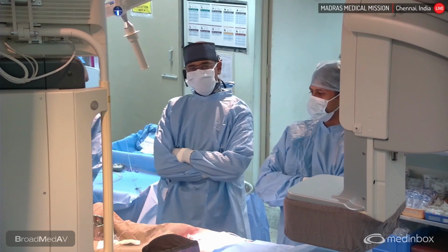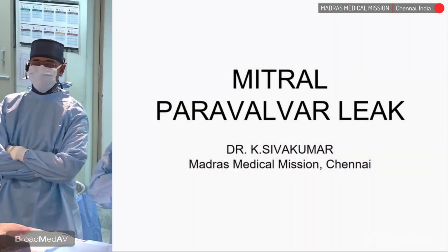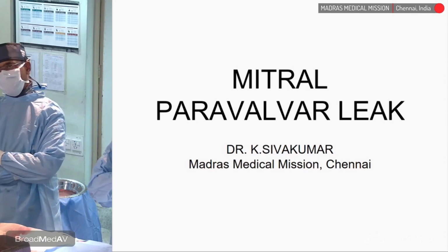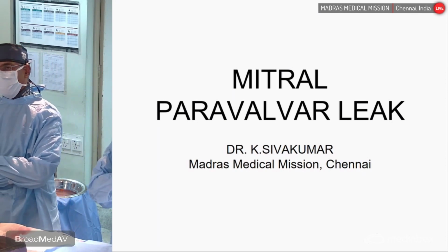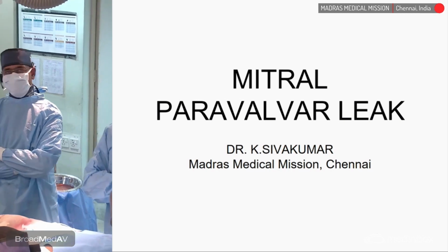And I would like Dr. Anselin, one of my colleagues, to give the clinical details of this interesting patient who has got a mitral paravalvular leak, which we are going to address by a transcatheter procedure today.